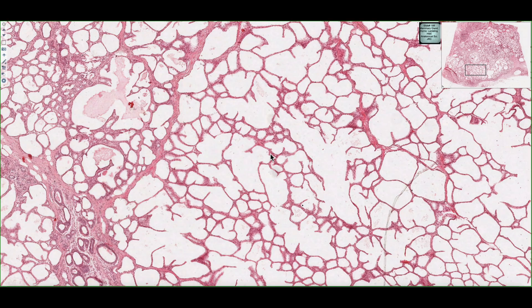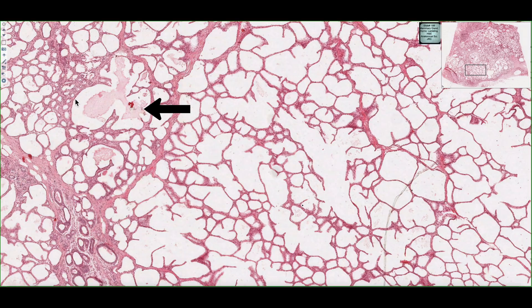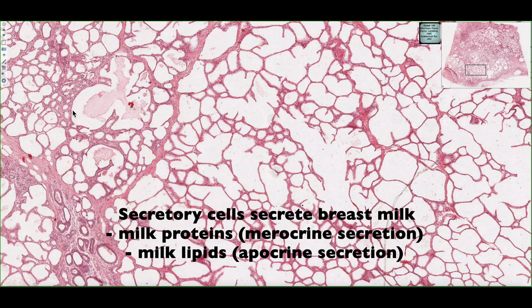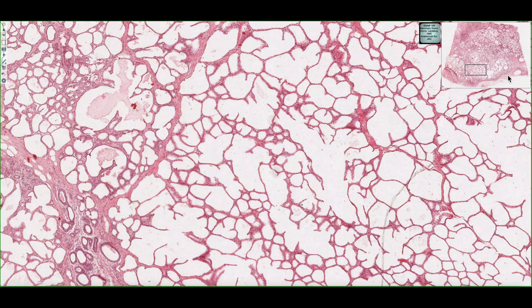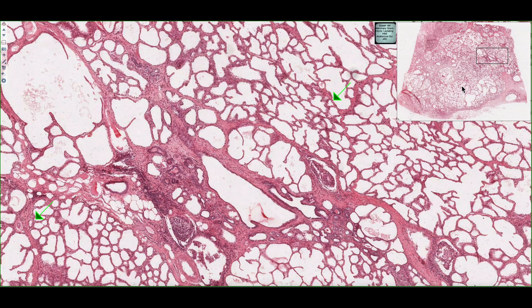We're now looking at a lactating mammary gland. We can see that the alveoli making up this mammary gland are now really dilated, and we can see the walls between the various alveoli. Some of them have a buildup of breast milk, which is composed of milk lipids and milk proteins. The milk proteins are released by cells surrounding the alveoli through merocrine secretion, where they are released directly into the lumen with no loss of cytoplasm. However, some cells secrete the milk lipids through apocrine secretion, in which they actually do lose a portion of cytoplasm along with the secretory product.